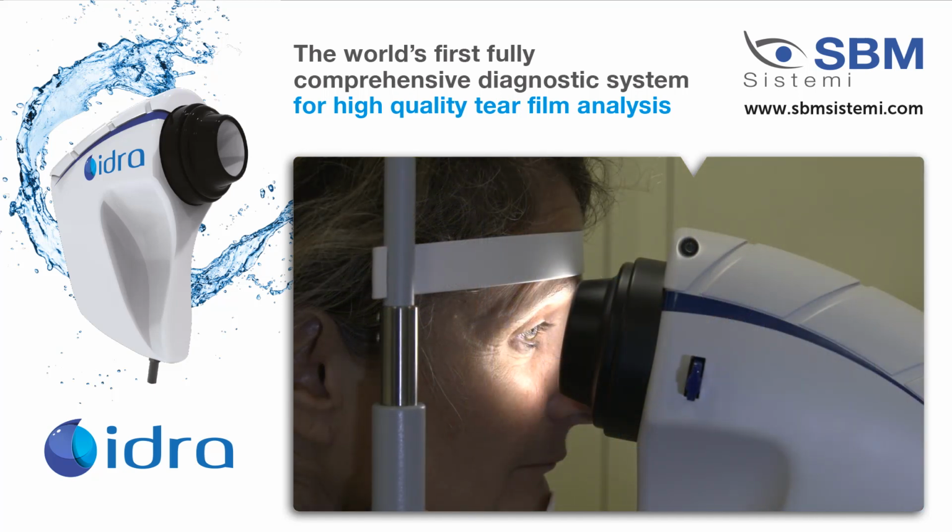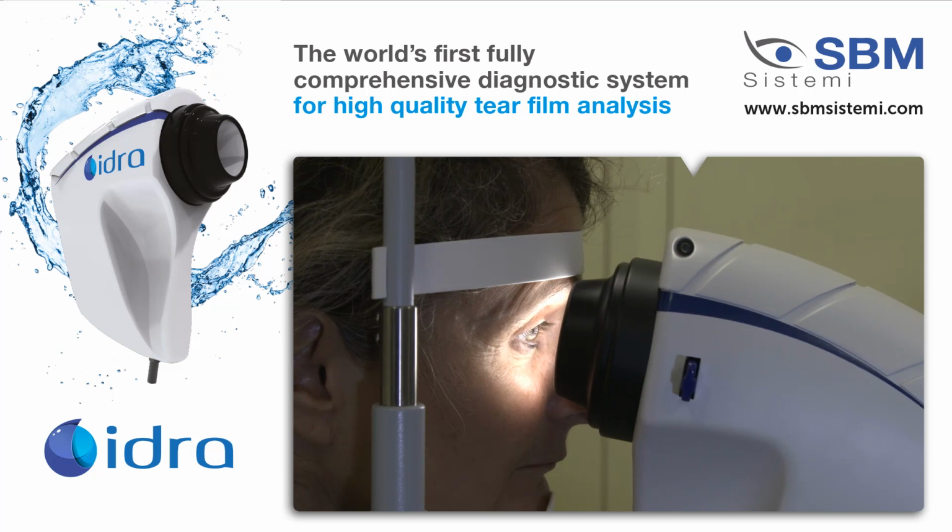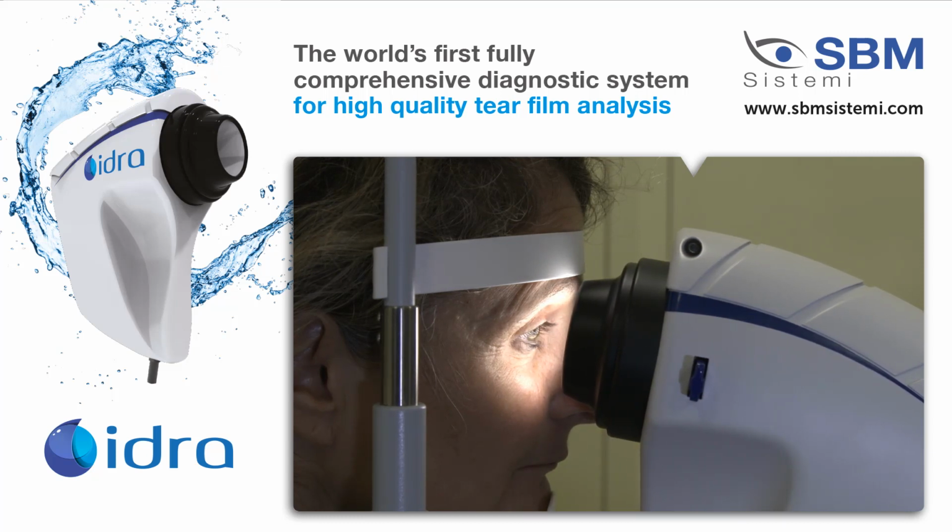To perform the interferometry, you place the white cone within the device, and then you just move forward to focus on the iris, and then pull back a little bit, and you'll see the lipid layer moving upwards and associated with the blink. You just blink twice, and then keep looking. And you can see the movement of the lipid layer and the tears and the tear stability.